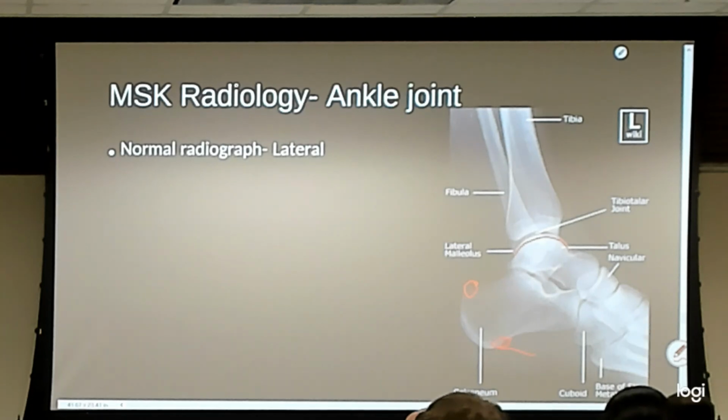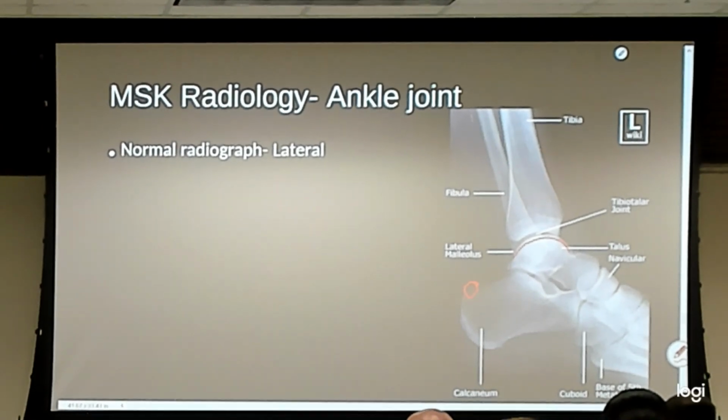So this is the plantar fascia. Basically, I see a change from one gradation to another. That's sort of what I see on yours too. I see kind of three gradations of gray right in that area. The one in the section in the middle is the plantar fascia. Okay.